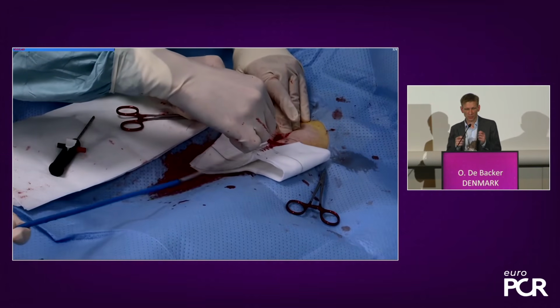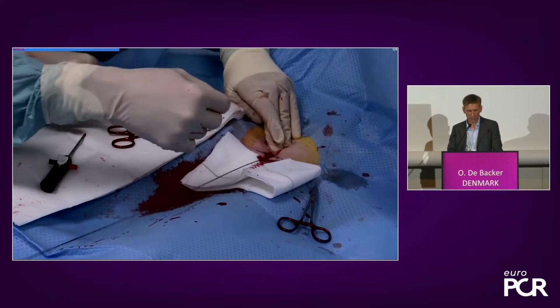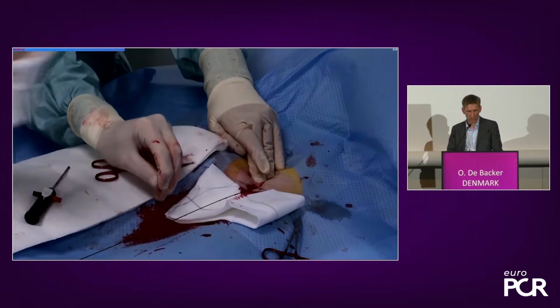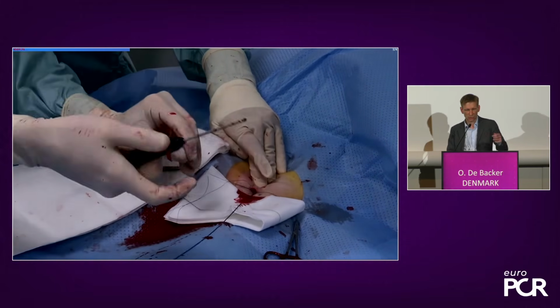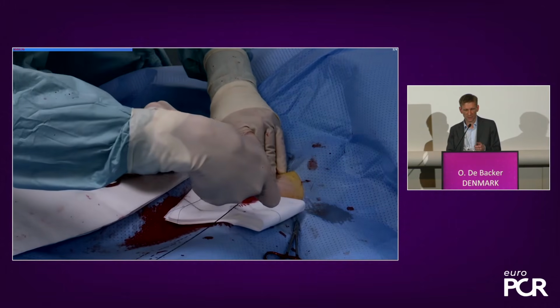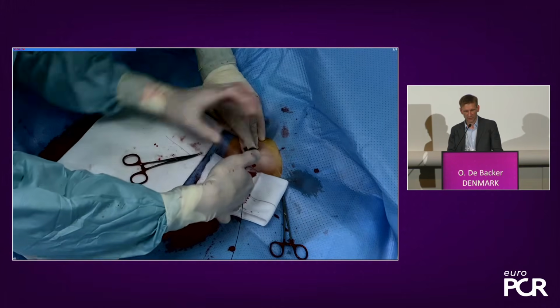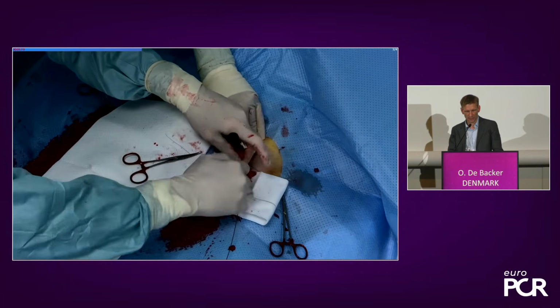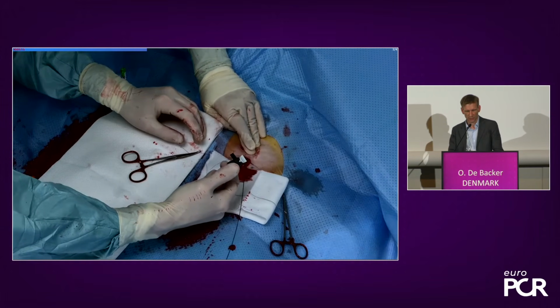What I do is I pull on both ends, on the 2 long ends of the sutures. And then I grab, as you see here in a short demonstration, the long end of the suture. You hold it almost like the string of a guitar, you kind of pull it up. And you see I will go in at 45 degrees with this and wrap it around my digit finger, and then I do it with one hand and I push with my thumb on the pusher.